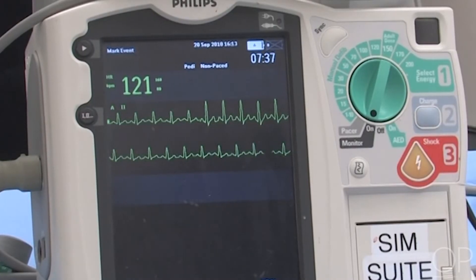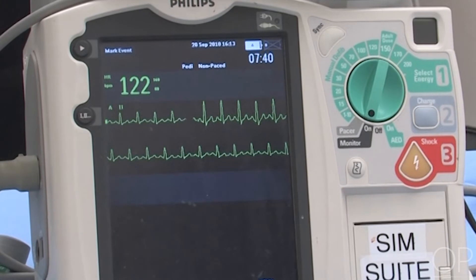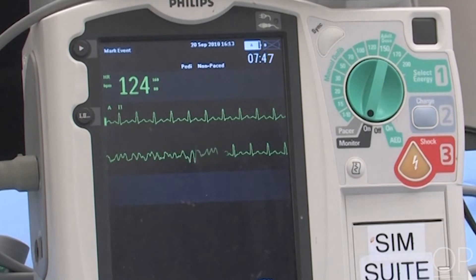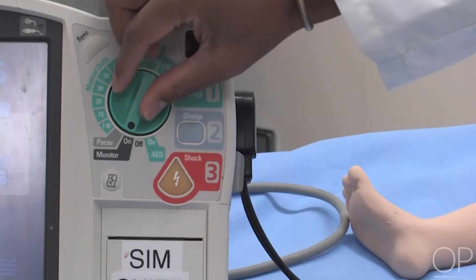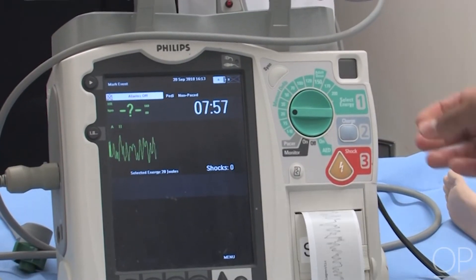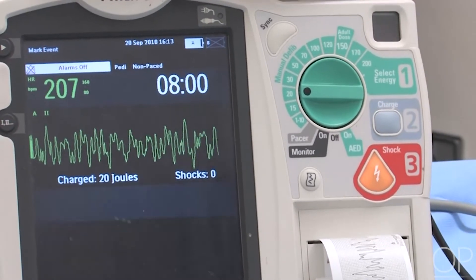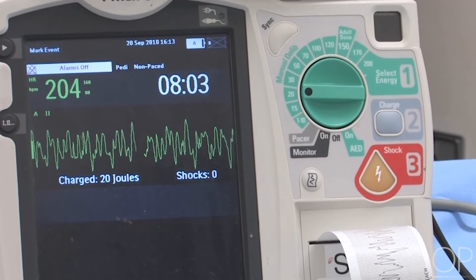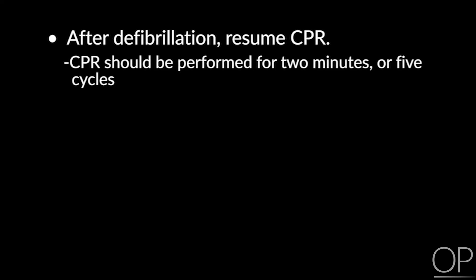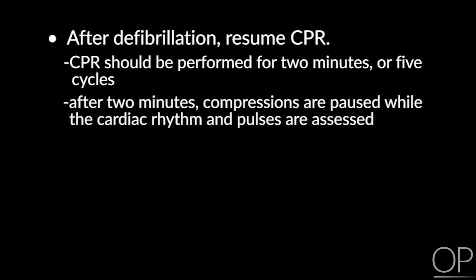We have a patient in sinus rhythm with stable vital signs. We have an acute change in the patient's rhythm — a coarse baseline, a hemodynamically unstable rhythm. We start by selecting 2 joules per kilogram for the 10-kilogram infant — 20 joules. We charge the device. We say: 'I'm clear, you're clear, we're all clear.' We discharge. After defibrillation, resume CPR. CPR should be performed for 2 minutes or 5 cycles. After 2 minutes, compressions are paused while the cardiac rhythm and pulses are assessed.